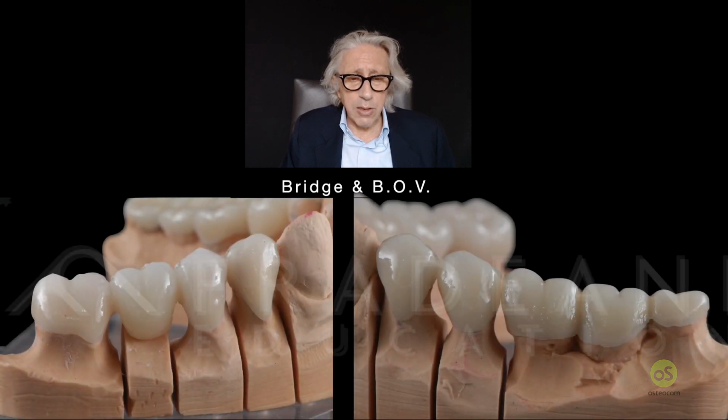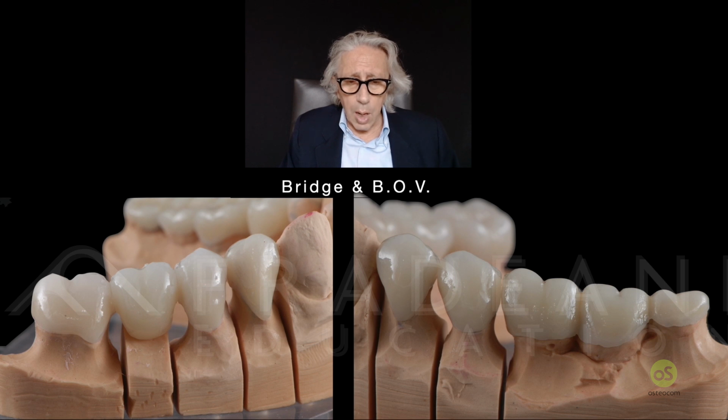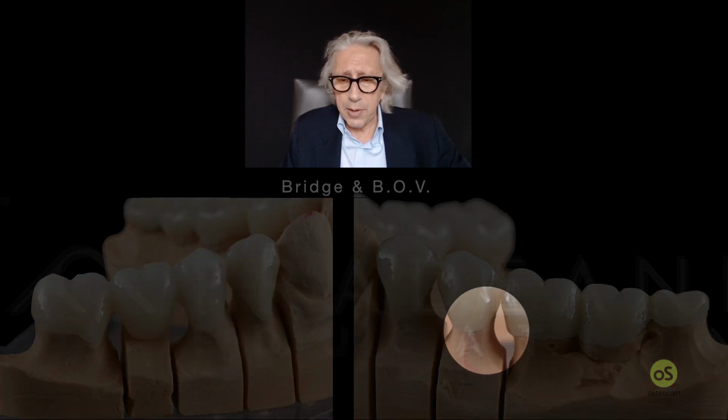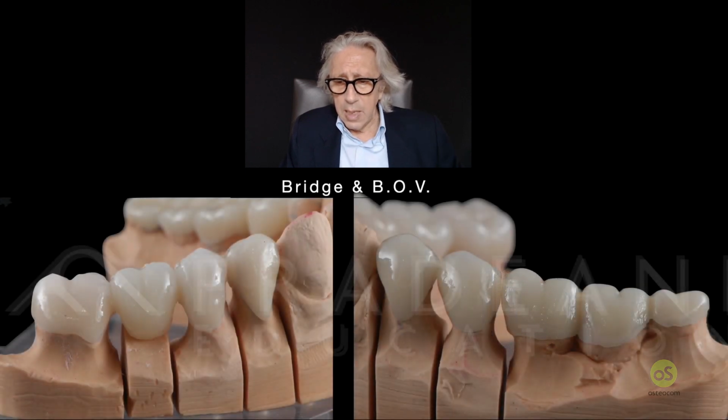The case was done in lithium disilicate, the bridge was done in cubic zirconia. And here we have prepared slightly the 3 implants because they were perfectly integrated. We just cut back a little bit and roughen all this area, and then we can cement it over ceramic.